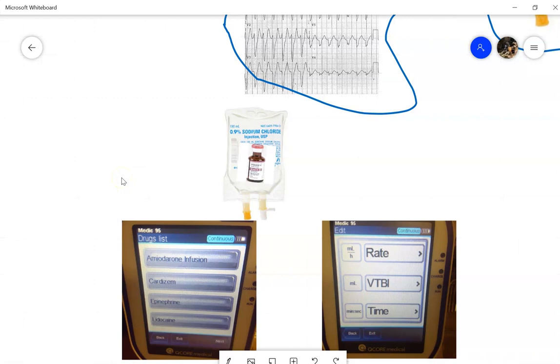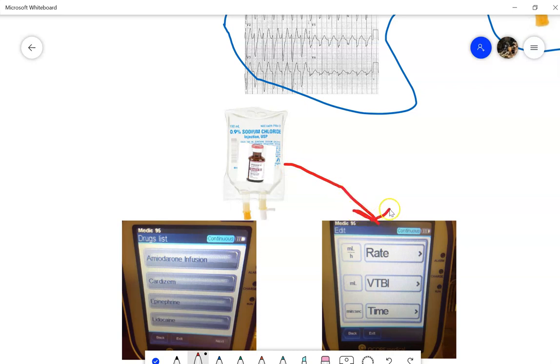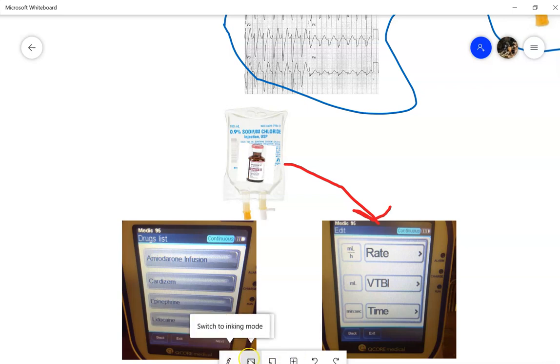that's going to be the bolus. We're going to be giving a bolus of amiodarone. So hopefully you recognize right away that if we're going to do a bolus of amiodarone, we are going to be looking for this screen here, and this is going to be in general mode. So we would find this screen here. If you need to, go back in the other videos and take a look under general. So that's where we would be putting it in. We'd be looking for that general screen.